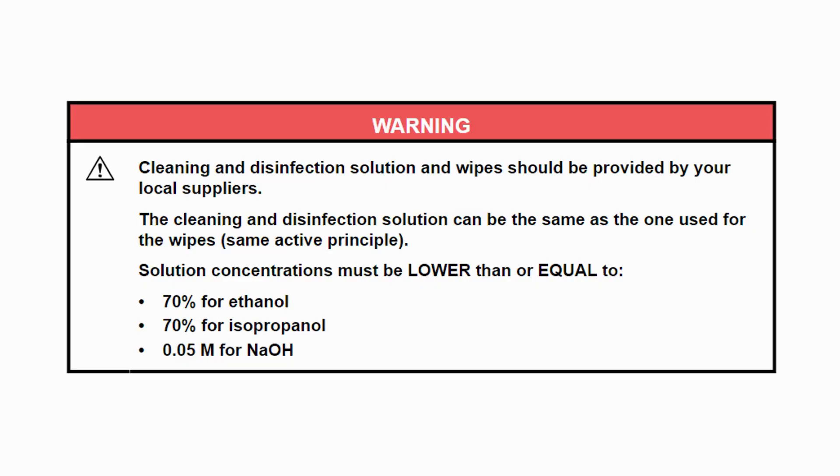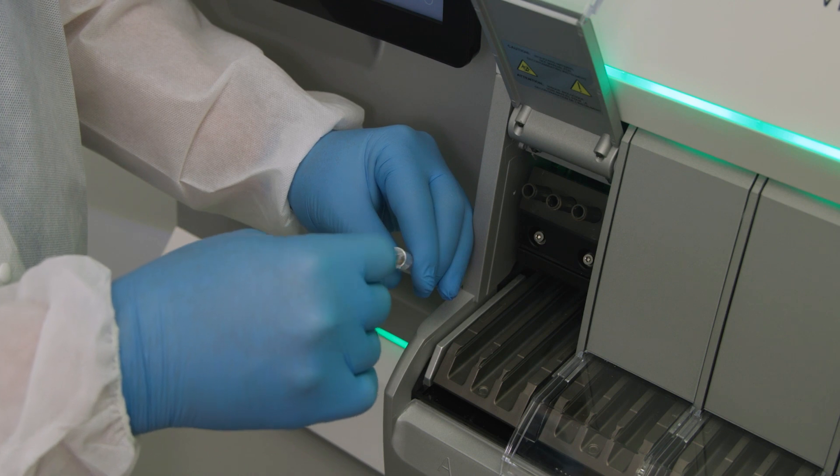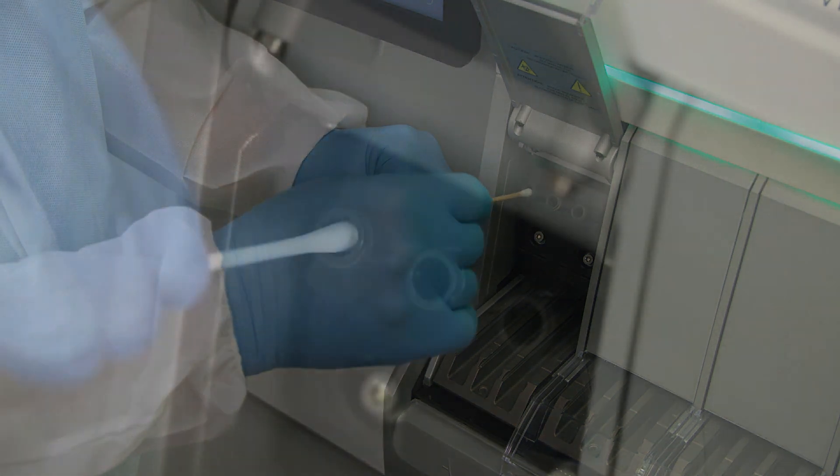Using a Dacron swab moistened with a detergent solution, carefully clean the interior of each spur liner.